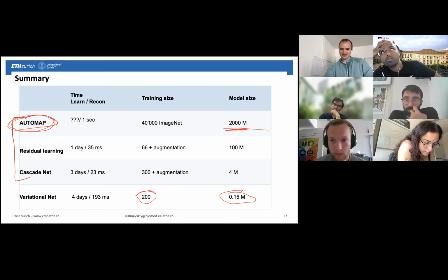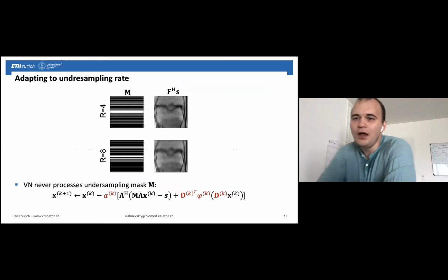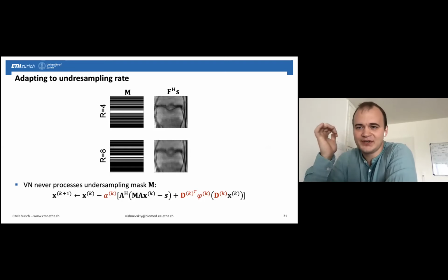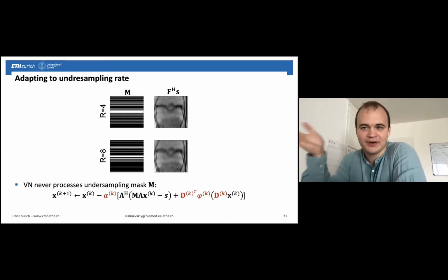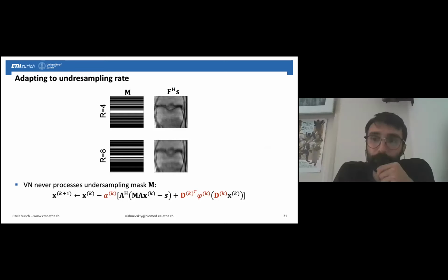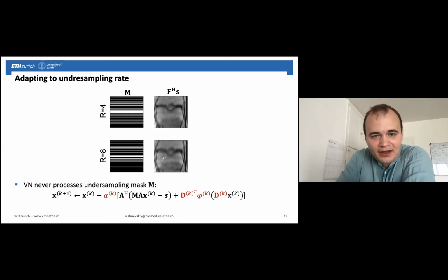Oh yeah. I think you're now also referring to the paper, because I actually forgot to mention the generalization with respect to undersampling rate. Here you can see that in this MRI problem we had very limited data. But if I provide you one network that can reconstruct at least training data, it will be much more convincing if I say that it works for a range of the acceleration rates, because you can see here these aliasing artifacts.